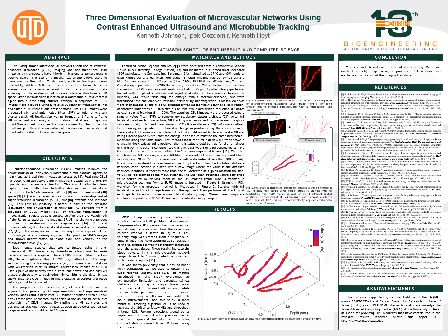In conclusion, this research introduces a method for creating 3D super-resolved velocity maps using a preclinical ultrasound scanner and mechanical translation of the imaging transducer.